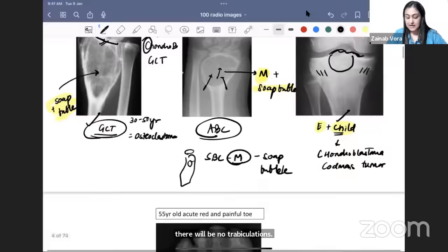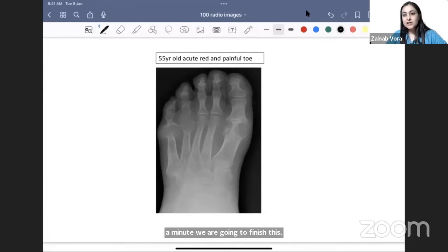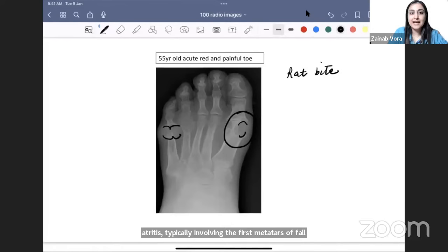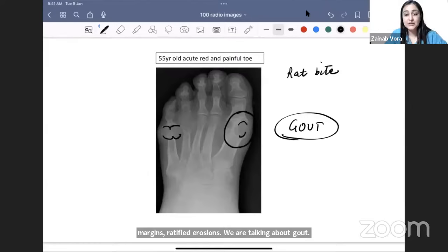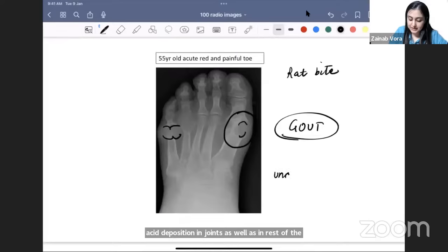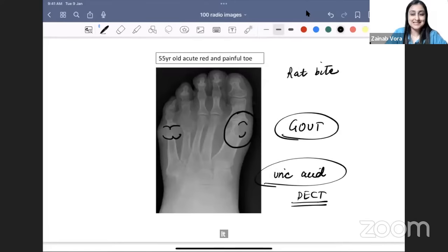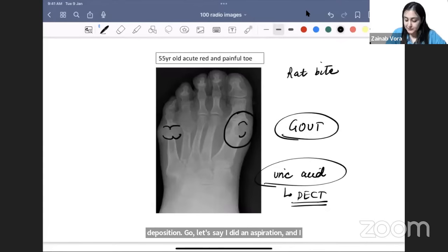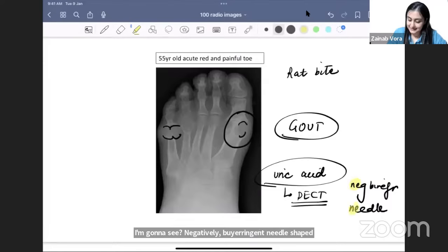Next: older person with acute monoarthritis typically involving the first metatarsophalangeal joint. These large erosions with overhanging margins are called rat bite erosions — we are talking about gout. A dual energy CT can tell us uric acid deposition in joints and soft tissue. On aspiration under polarizing microscopy, we see negatively birefringent needle-shaped crystals — NE, NE — that is how monosodium urate appears.